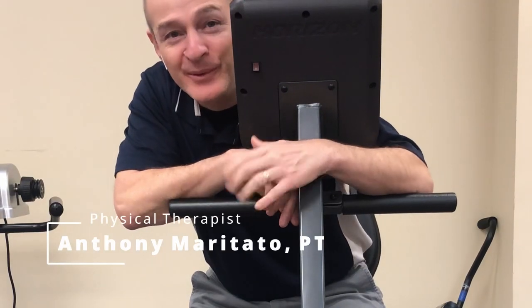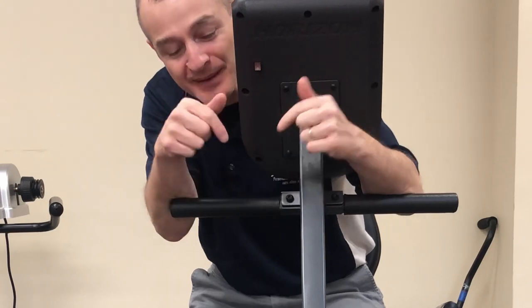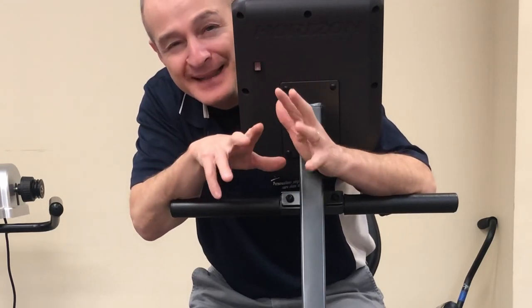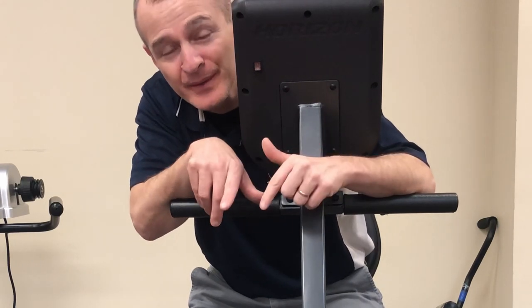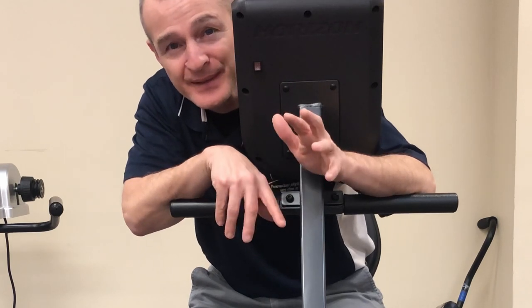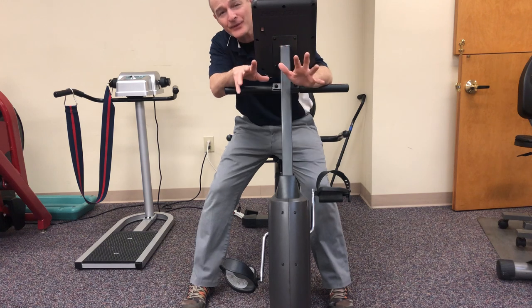Welcome to the Knee Replacement Support Group YouTube channel. In this video we're going to talk about the recumbent bike — how to set yourself up, how to get a little bit of an advantage, how to do things that maybe you couldn't do before. I'm going to show you a couple tips and tricks we use here in the clinic to use the bike more effectively.